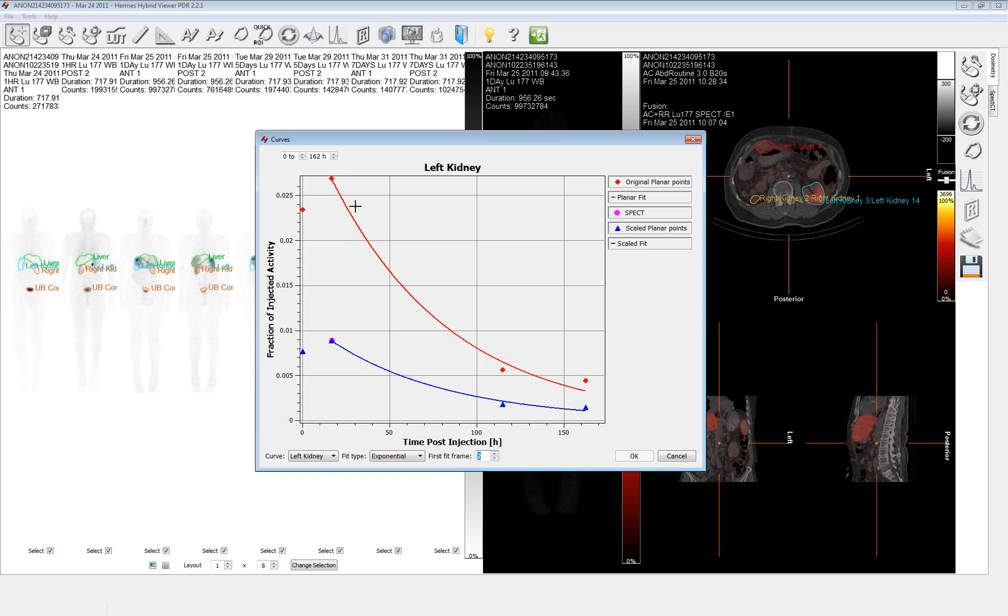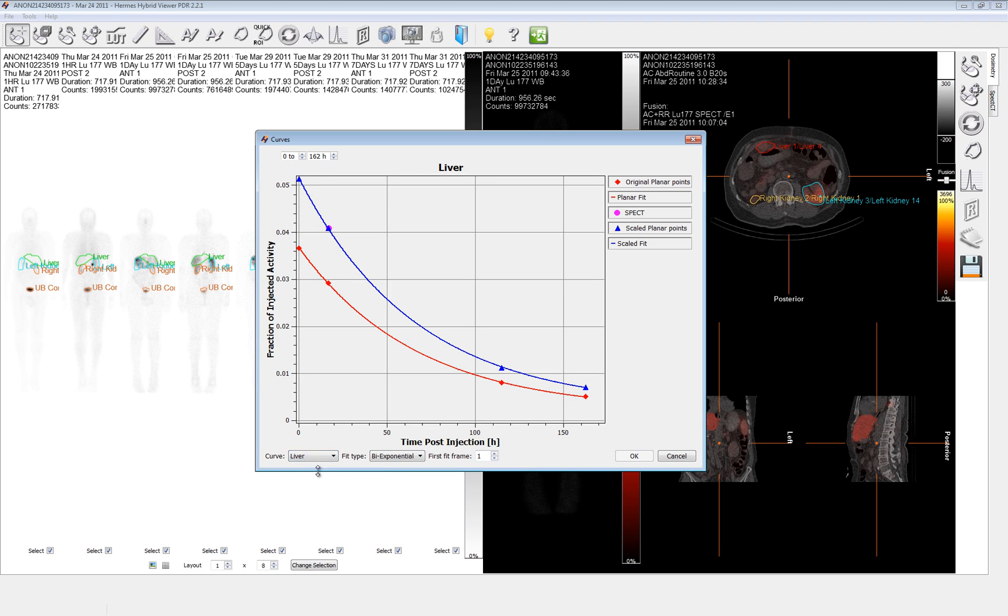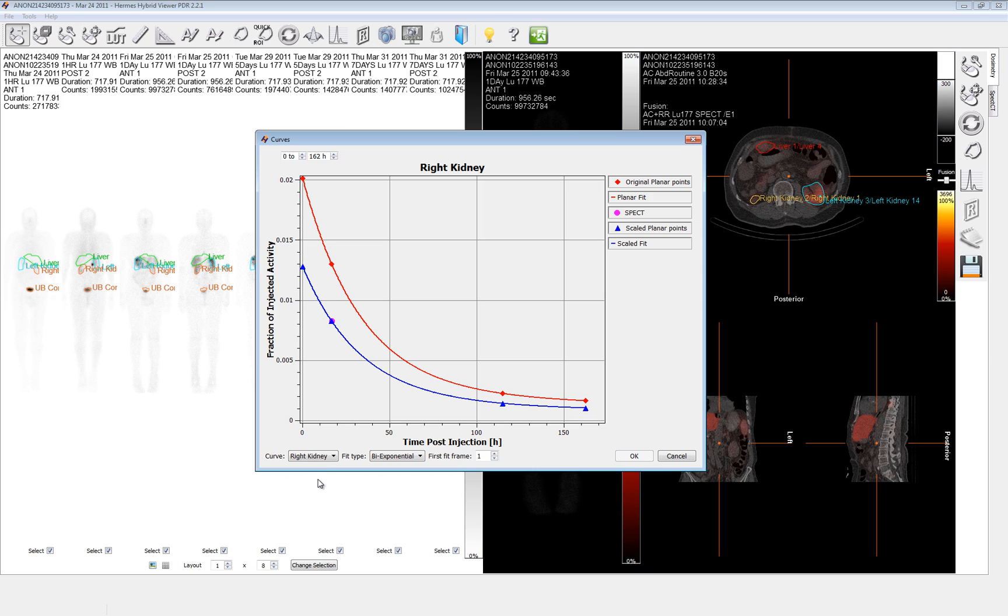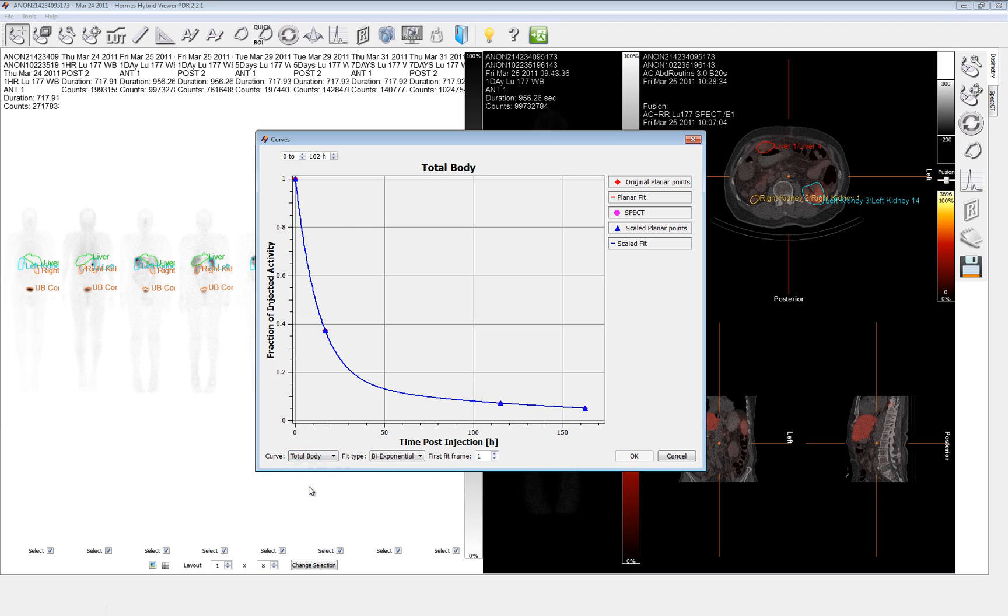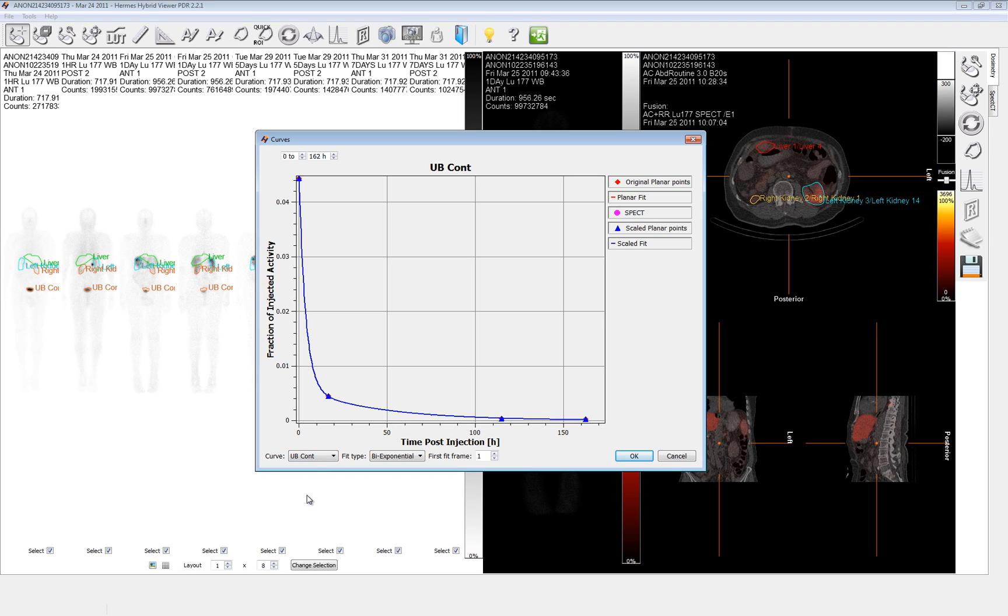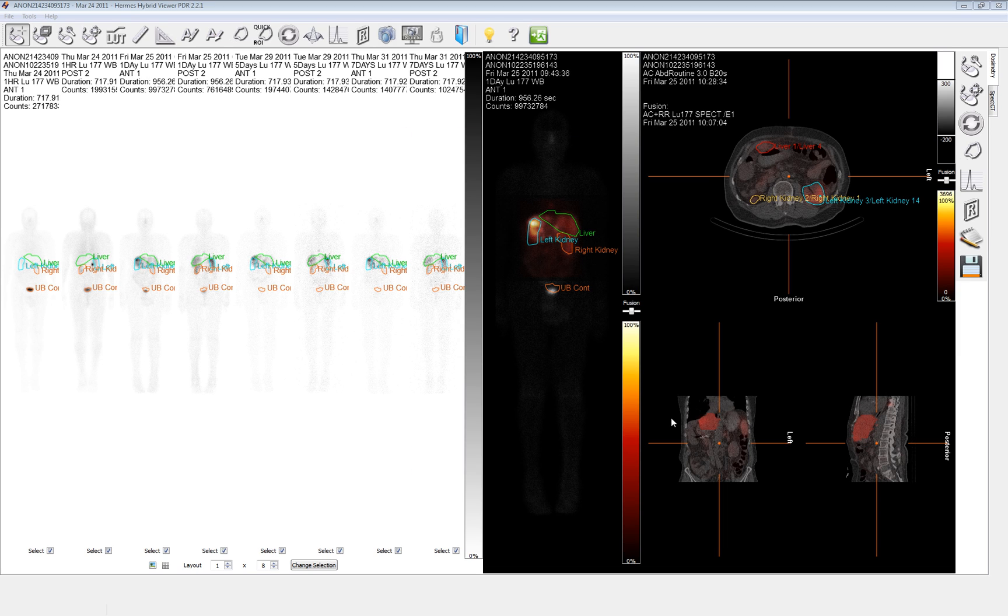And then we'll be doing an analytical calculation from there. These two curves are the curves raw from the whole body. And then this pink dot is the value from the SPECT, and we've scaled the curve to fit that SPECT time point. We have to do all of the organs that we've defined. So again, we've got the liver. In this case, the attenuation correction is probably what's actually caused this to go up higher. Right kidney, total body exactly the same. And the urinary bladder contents also a very good fit. So after clicking OK, the numeric should be following through.